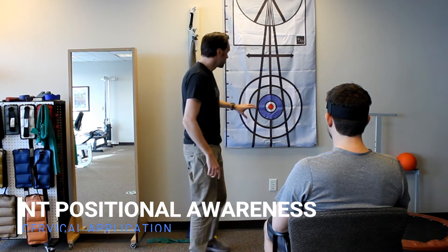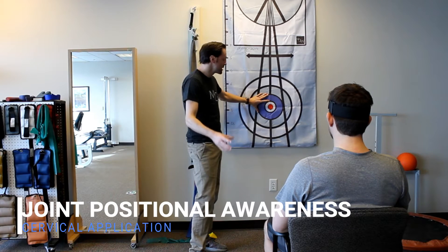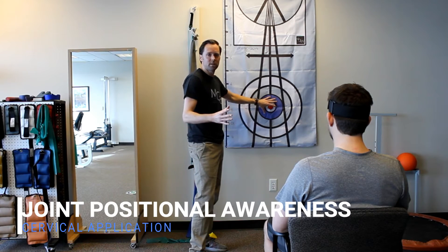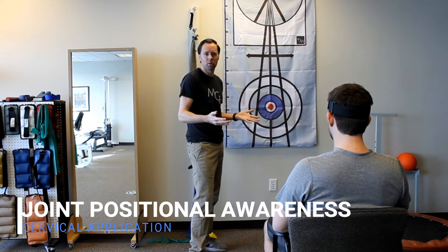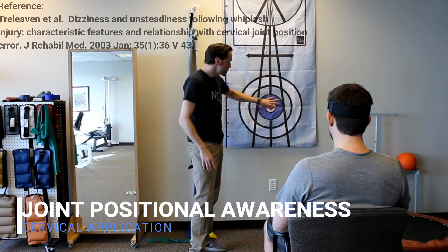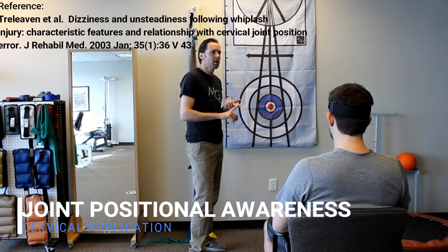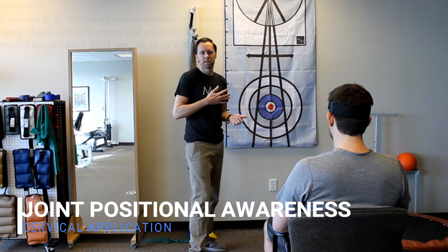This circle here is standardized for a distance of five feet away if the patient is sitting. If they're able to come back to this target anywhere in this blue circle from five feet, that's showing somewhat within what a normal population can do — a population without pain, without injury. If Chris is unable to return to this blue circle and is outside of that, that would be outside of the standard deviation, which could be considered an error or poor proprioceptive skills. You want to test that in repetition.